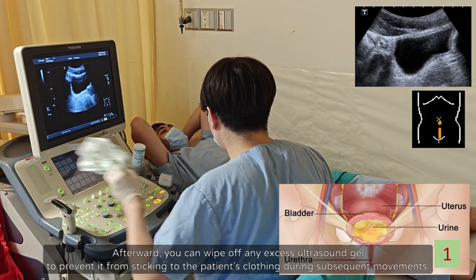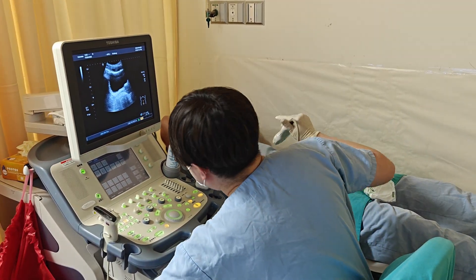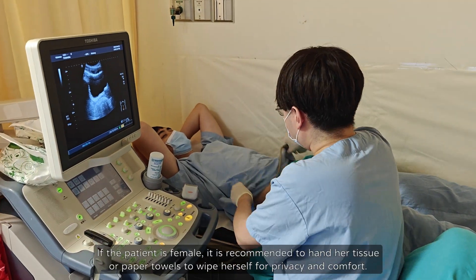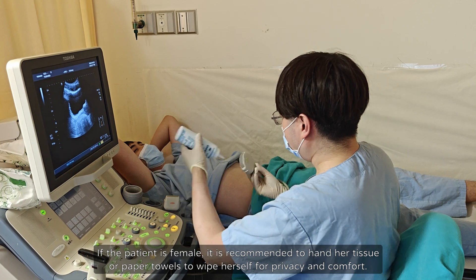Afterward, you can wipe off any excess ultrasound gel to prevent it from sticking to the patient's clothing during subsequent movements. If the patient is female, it is recommended to hand her tissue or paper towels to wipe herself for privacy and comfort.